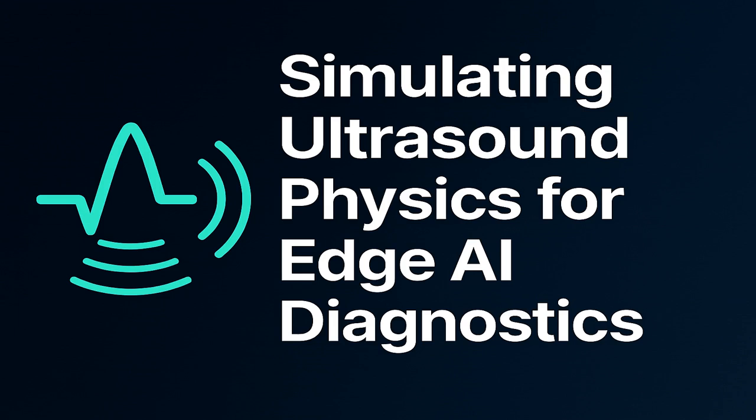It's huge. But if you drop down to a 2.5 MHz probe to get more penetration, the loss halves to 25 decibels. You get a much, much stronger signal back. But you sacrifice that beautiful 0.3 millimeter resolution you had with the 5 MHz probe. That's the trade-off. It's unavoidable. And simulation engines have to model this attenuation perfectly to match what happens in reality.